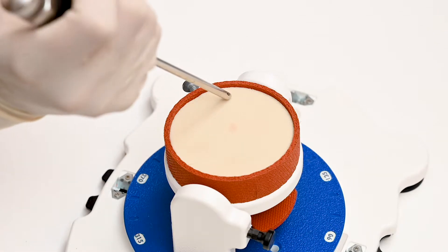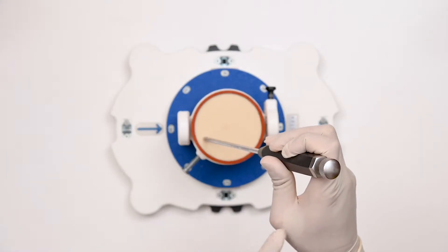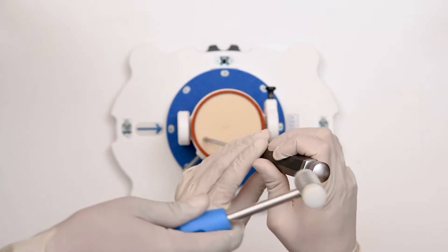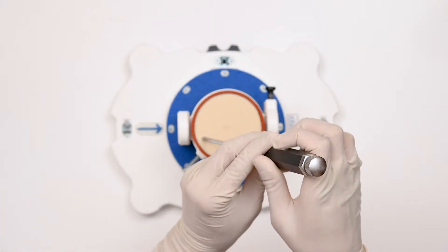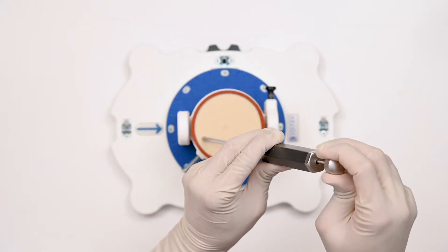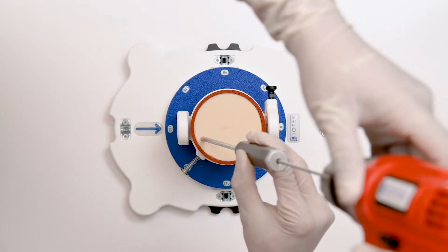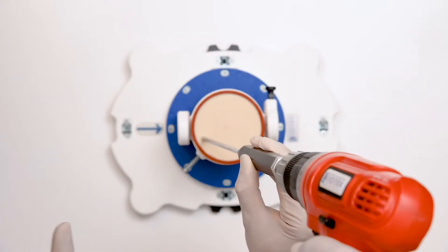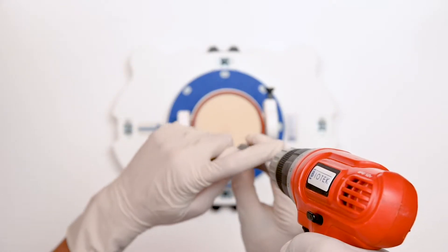We insert the sphere and trocar. After confirming the proper position, we hammer the trocar inside. It comes with an auto-stopper so that it will stop automatically once the desired length is inserted. After removing the trocar, we insert the drill bit. After reaching the desired length, it will stop automatically because it comes with the auto-stopper.